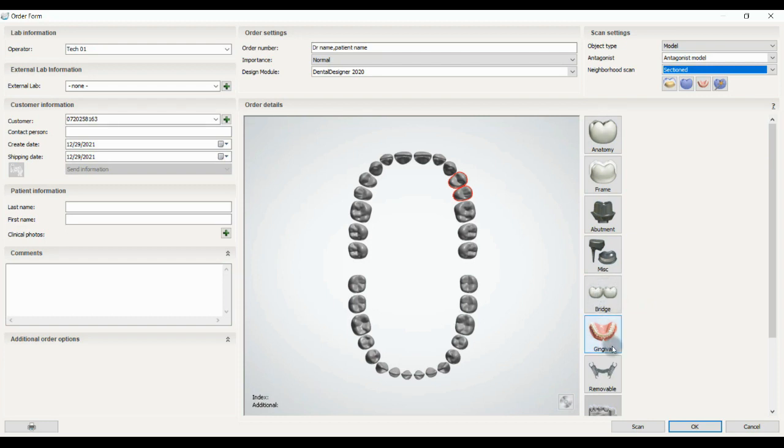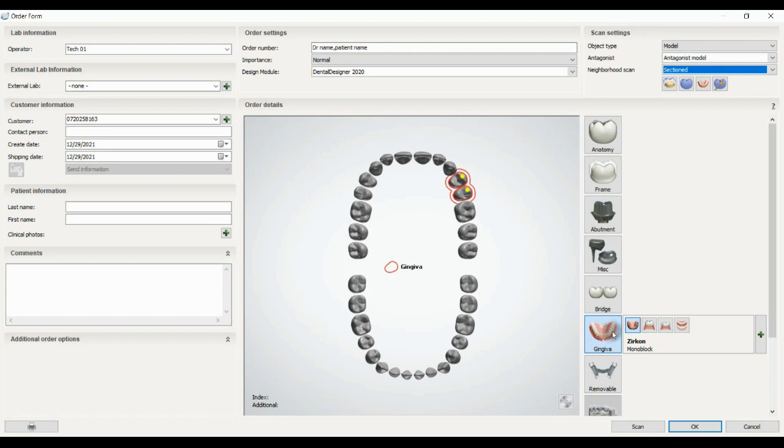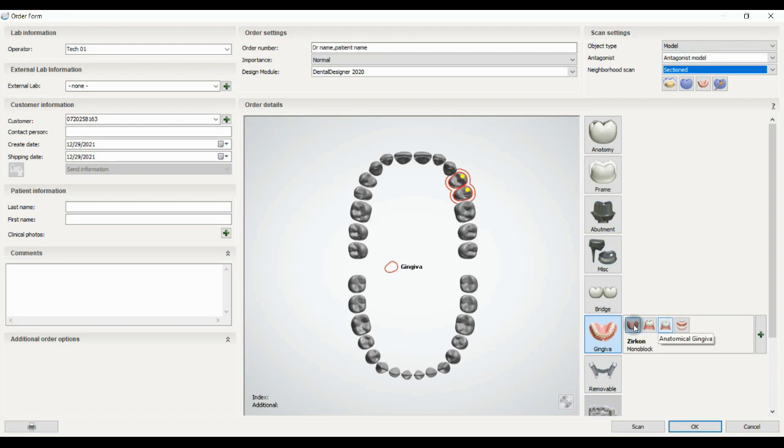The next is gingiva. We can use a denture gingiva in monoblock, which means when it prints it's in one piece. We have gingiva in separated, which will be in two pieces, anatomical gingiva, and copy denture, where the denture is scanned and everything is fine, we just copy.